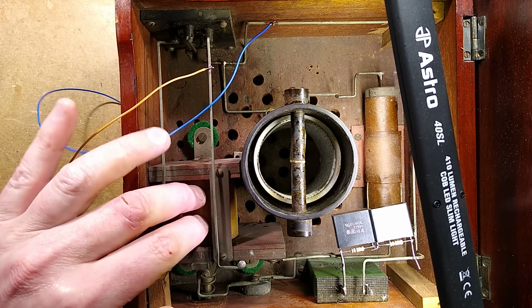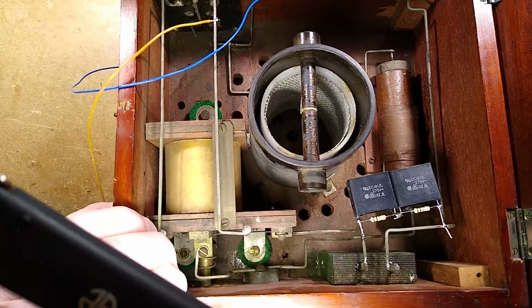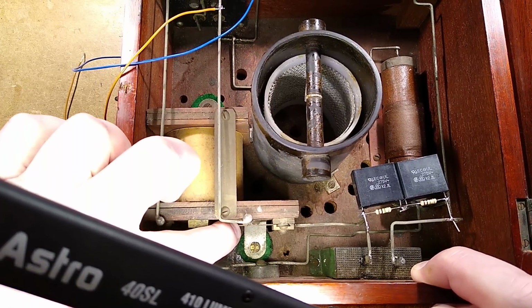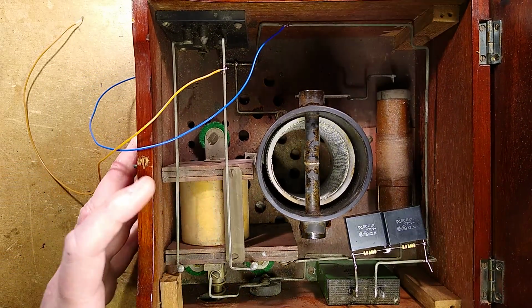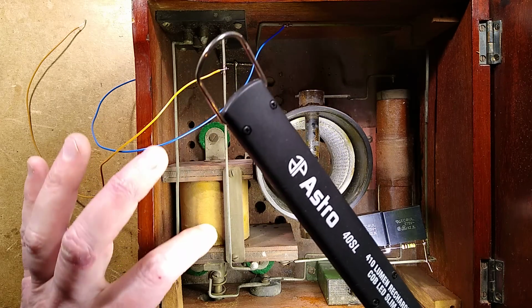This is the main interrupter coil, and down here, you may be able to see a little metal strip, that is the interrupter strip. And it's got a contact on it, a bit like an electric vibrator, so to speak. Doesn't sound right, but you know, it was from the same era, let's face it.